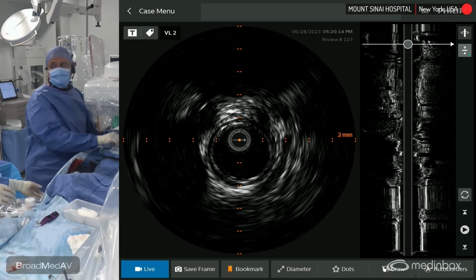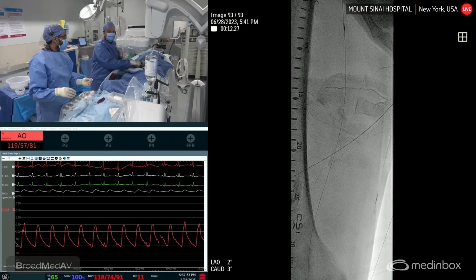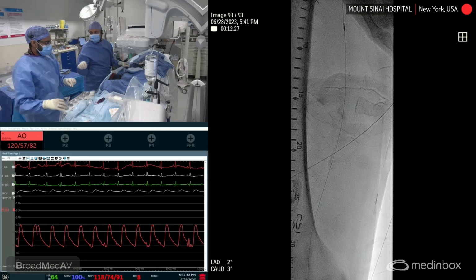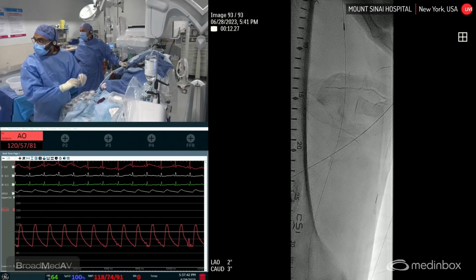Do we have a 200 impact or no? We have a 150 018. We have a Ranger 200. Oh, give me the 018. Ranger 200 then. Give me the Ranger 200.